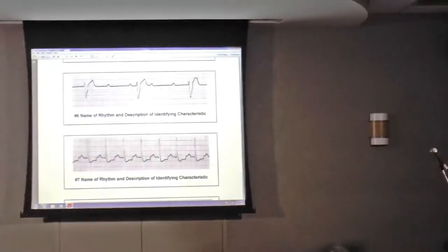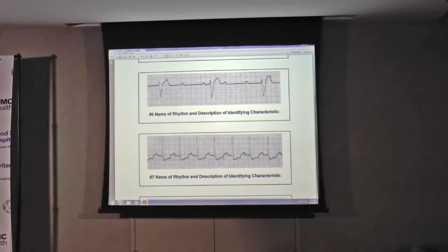Okay, so now number six, what do we have? I think it's pretty easy that we could see the rate is pretty slow, dramatically slow.